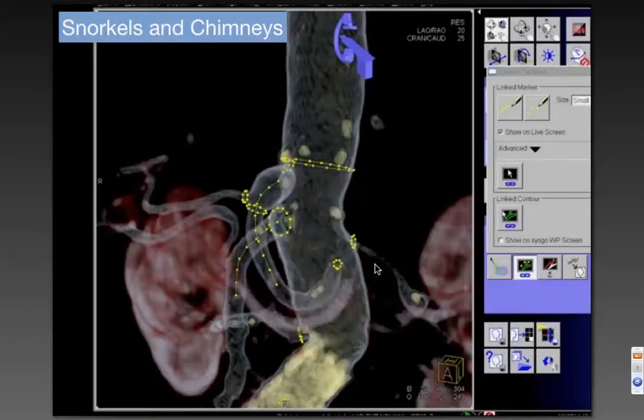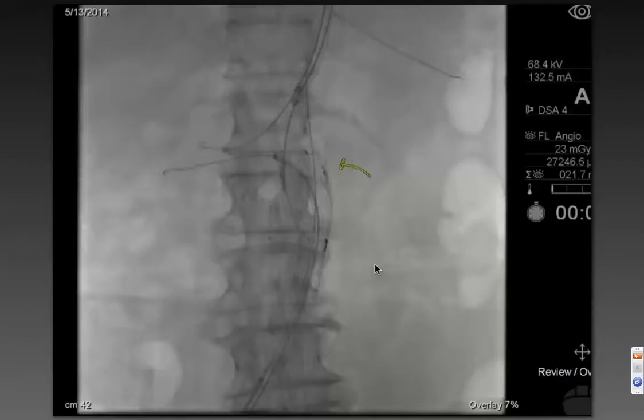We'll draw in those circles where we want to land the endograft. We'll draw in the origins of the visceral renal vessels and we'll draw in those center lines where we would like to see the wires. You can choose to overlay all of these, or in this case, you can choose to overlay the one where we're having trouble with.